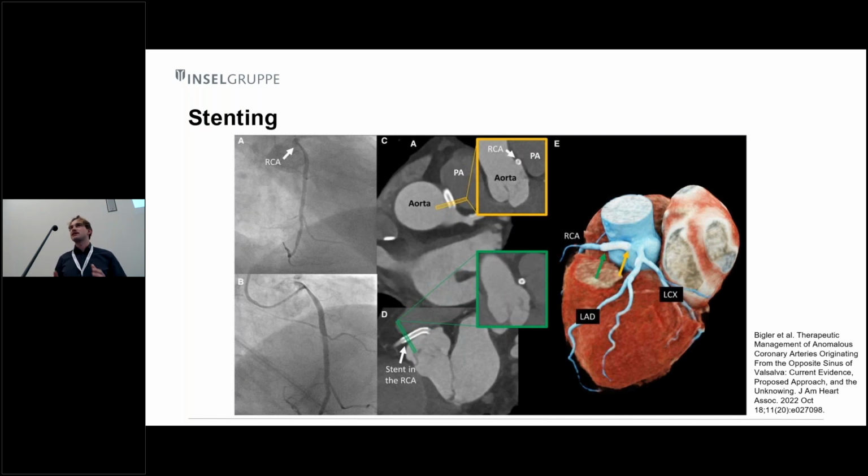So currently everybody's blocked a little bit, but we started to still do stents in older patients where we don't want to give them an operation. We had that in 3 patients now, and in one we also had already a bit of intimal thickening and restenosis. So I'm not sure if it will actually be feasible. But it would be an interesting topic again for simulations if you have a working model.